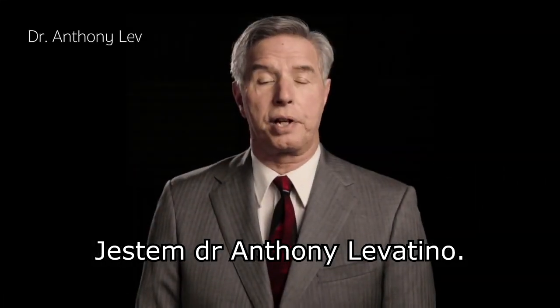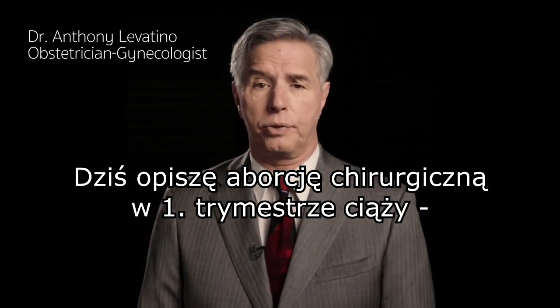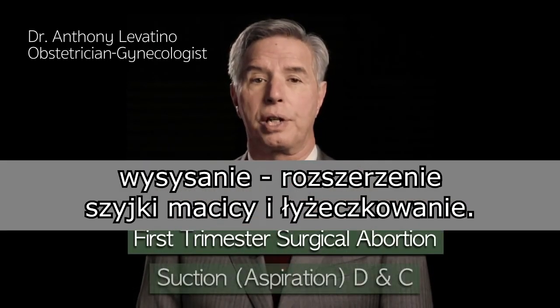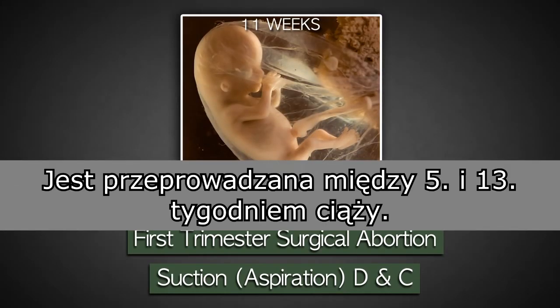My name is Dr. Anthony Levatino. I'm a practicing obstetrician-gynecologist and I've performed over 1,200 abortions. Today I'm going to describe a first trimester surgical abortion called suction D&C, dilatation and curettage. This is the most frequently performed abortion and is used typically from 5 to 13 weeks of pregnancy.